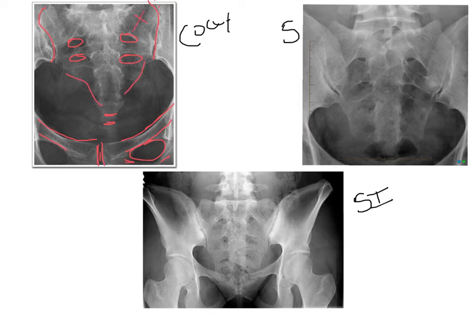Where these X's are up top, you are looking at the wings or the body of the sacrum. We see slight top of the base of the sacrum, and these to the left and right of the SI joints are your ilium. And remember, that is ilium with an I, not an E. E is for the intestines, two totally separate structures, so make sure that you spell it correctly.